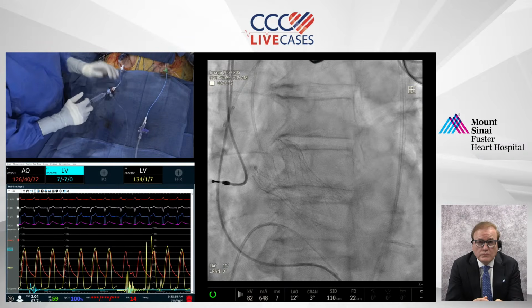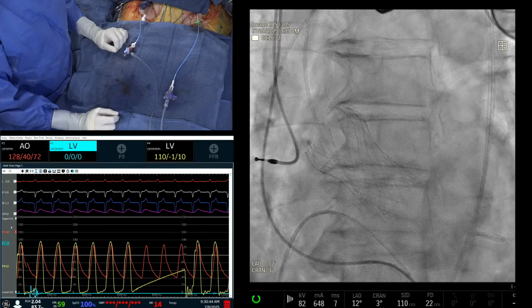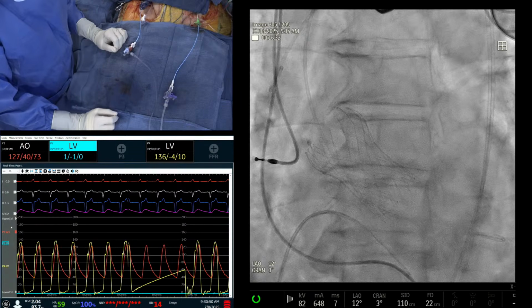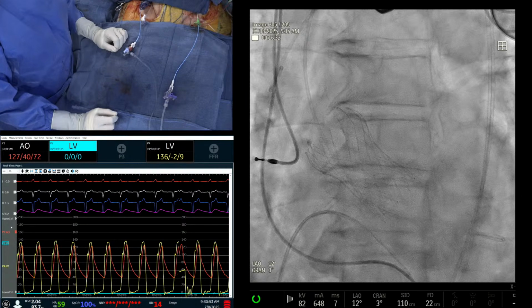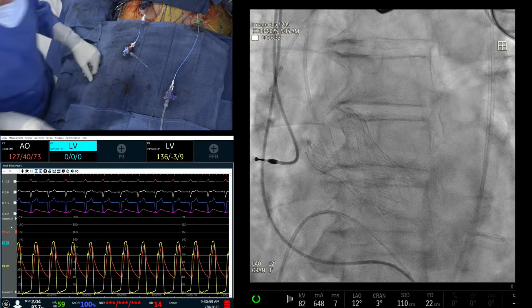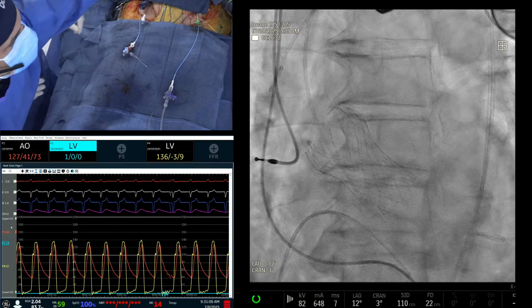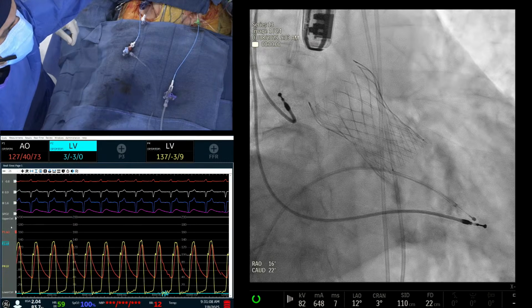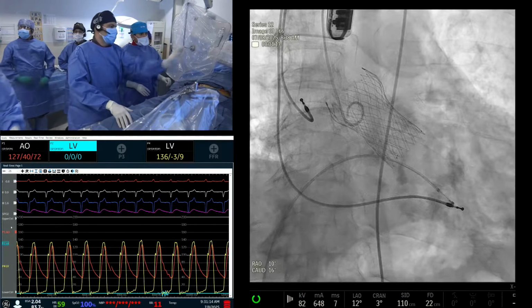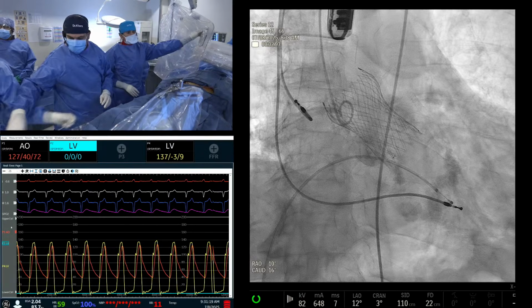Apollo. So the MS, so the Apollo right now needs to be at least moderate MR for MAC. So we have after 90 days for Apollo trial, and also have to make sure that LVOT is not an issue. So as you know, Tendyne is approved now for valve in MAC, but it's transapical, and so that's another option for this patient. Once we have the device available. So we will do this first, and then we will reassess you probably 30 days afterwards to see, in terms of evaluating for a Tendyne in MAC, probably the most realistic, or the Apollo trial.